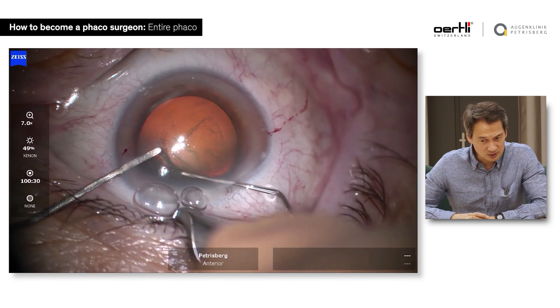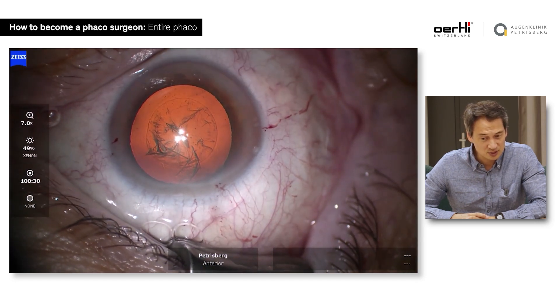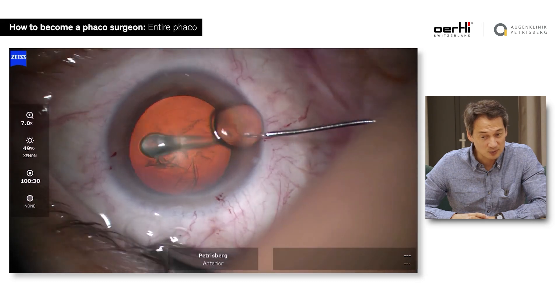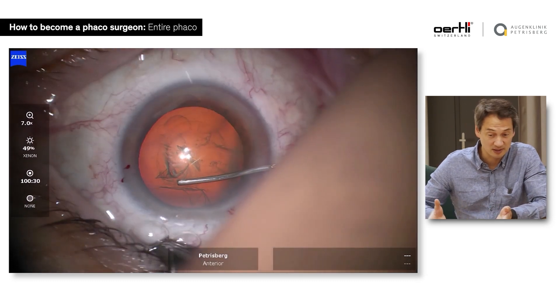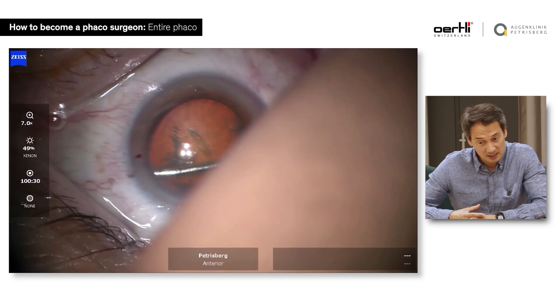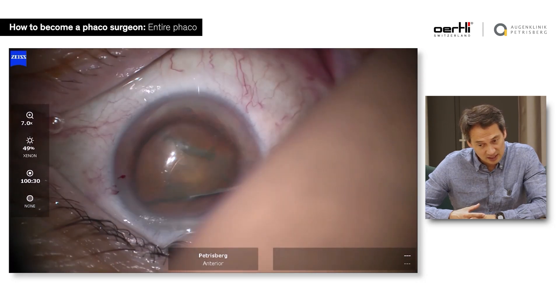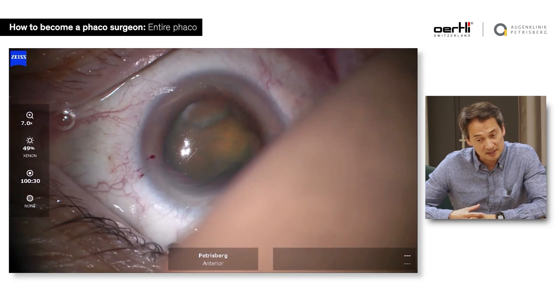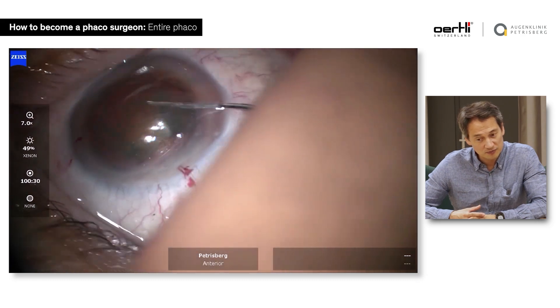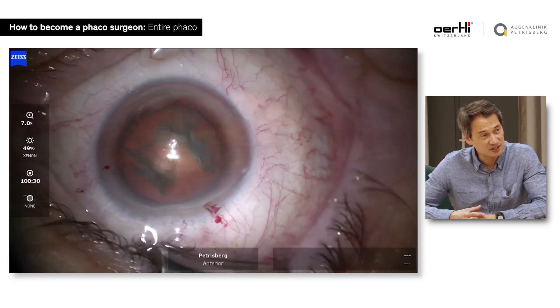Regarding the capsulorhexis, it's always good to have a clear and good red reflex. You can see that I'm not really managing that well all the time. This is me operating, by the way — this is real time. Hydrodissection, which we've talked about before, is very important.